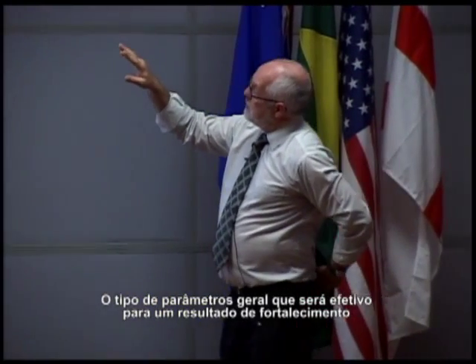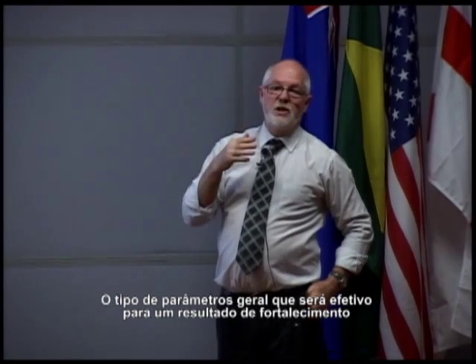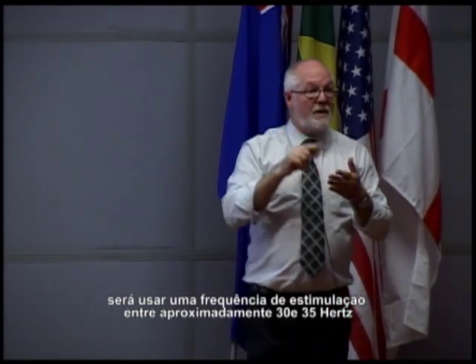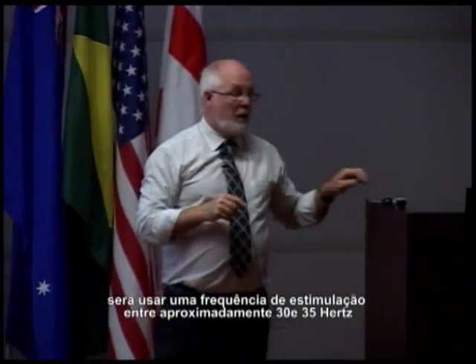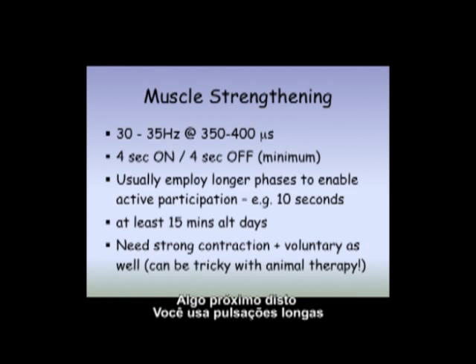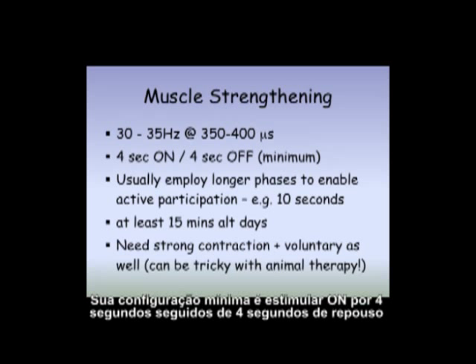The general parameters which will be effective for a strengthening outcome would be to use a stimulation frequency between about 30, 35 hertz, somewhere around there. You use long pulses, 350, 400 microseconds. Scott mentioned those earlier today.